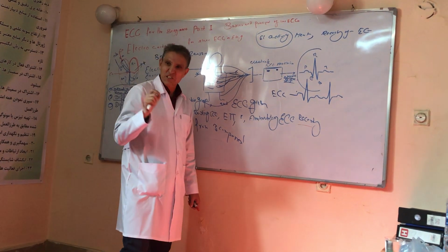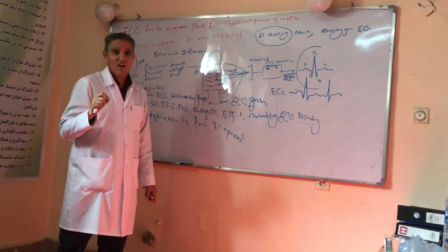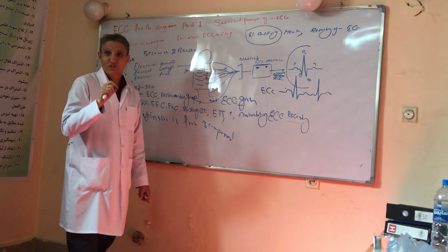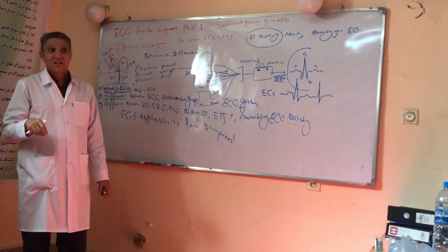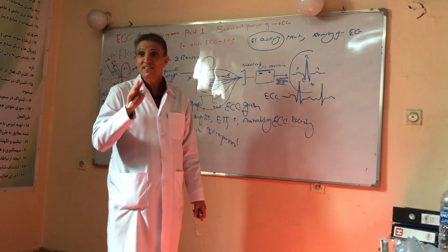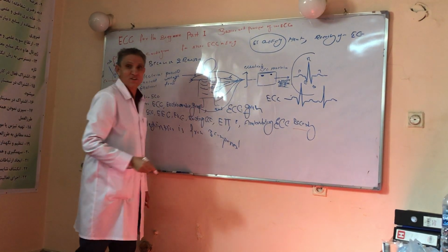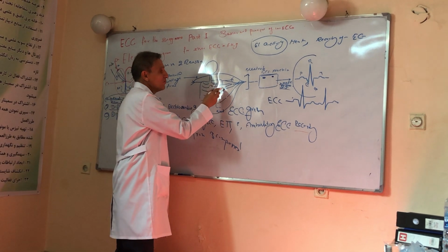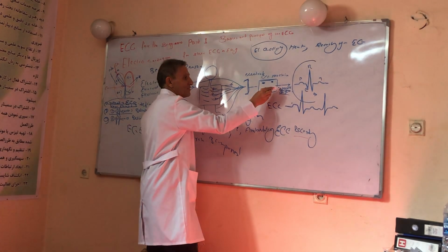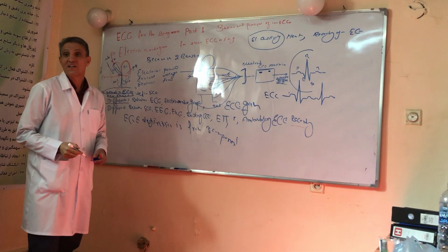So, a simple definition of the ECG: recording of electrical activity of the heart over ECG paper is called ECG. Or in other words, the electrocardiogram provides a graphic depiction of the electrical forces generated within these myocardial cells. This electrical force moves from inside of the chest to the outer surface of the body, to the skin. Then the electrodes attached to the body surface receive it, and finally they transmit it through the wire to the stylus or needle of the ECG machine and produce the PQRSTU wave. This is a typical pattern of the ECG.